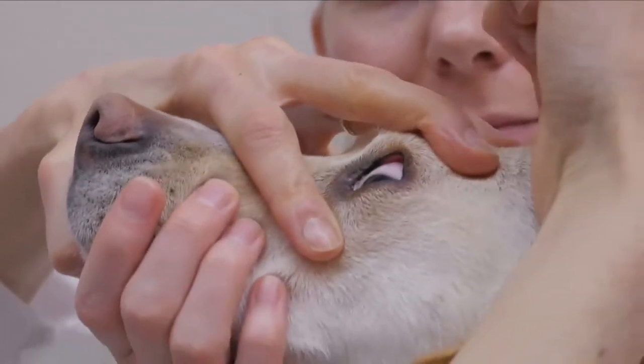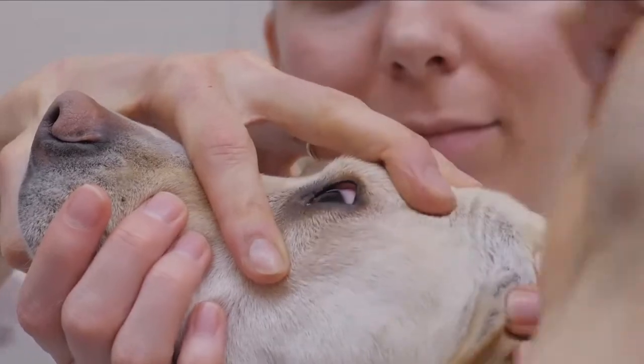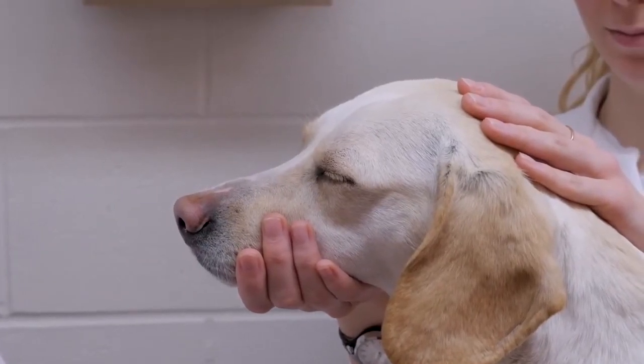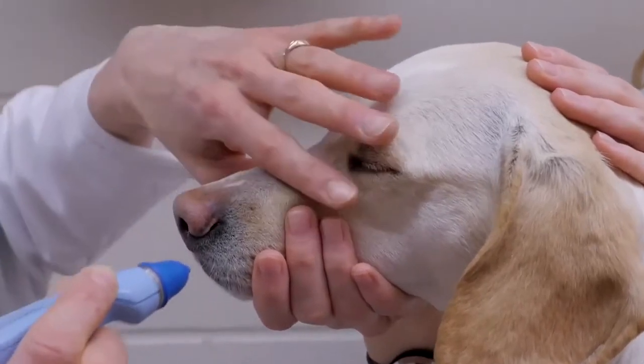Prior to applanation tonometry, topical anesthetic should be applied to the cornea as per indentation tonometry. The tip of the instrument should be covered with a disposable latex protective cap to ensure sterility and prevent tears from wicking up the plunger. The technique is best performed with the patient in sternal recumbency and minimally restrained with the neck position 90 degrees.